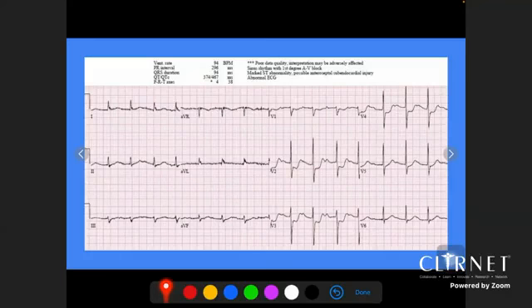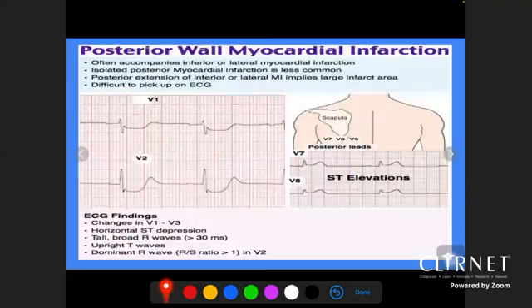And it represents around 4 to 7% of patients with MI. So if you are seeing per month like 100 cases of MI, you may find like 5 or 6 cases with this pattern. Either it will be missed or labeled as non-STEMI, or sometimes will not be diagnosed correctly.